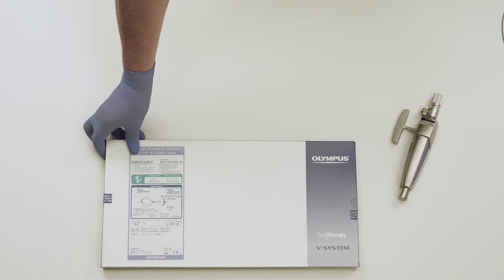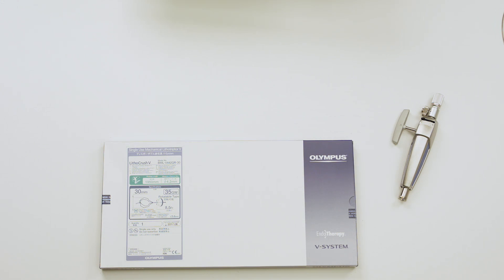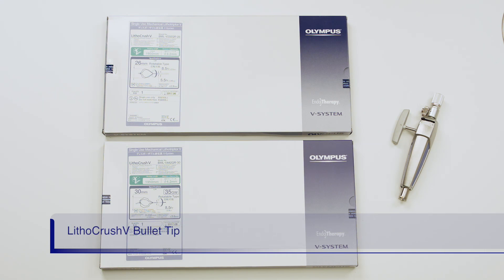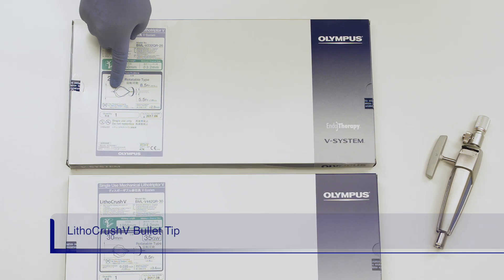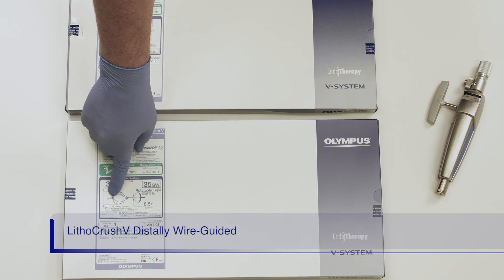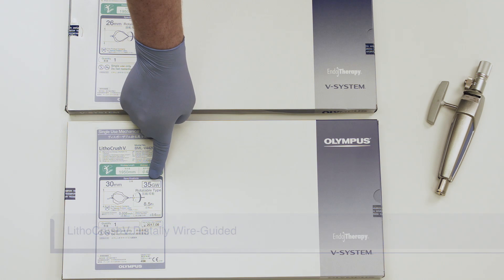Let's review the assembly of the Lithicrush V mechanical lithotriptor. There are two different versions of Lithicrush V: one is the distally wire guided version, and the other is the rotatable bullet tip version. Be certain of which version you have by looking on the box, which will indicate either bullet tip or distally wire guided. On the distally wire guided version, there is an indicator for compatible guide wire size.